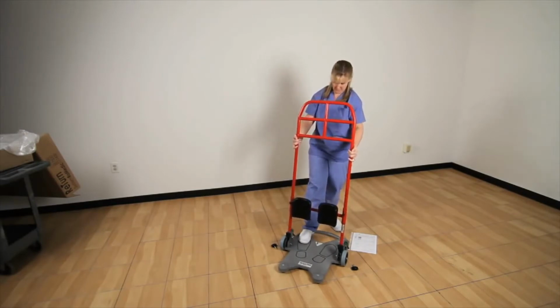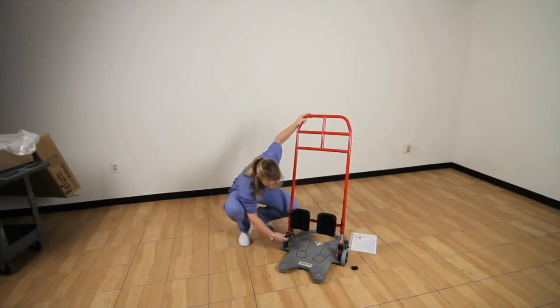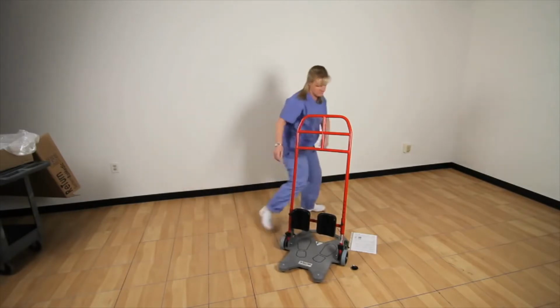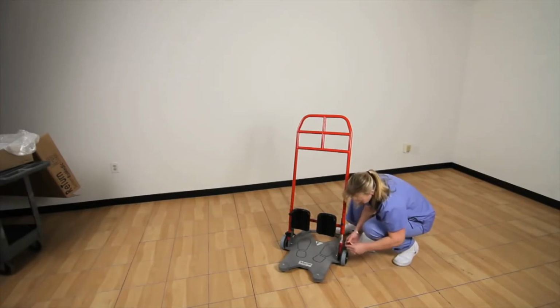Put the red ladder on the base so that the height adjustable knobs are facing the curved side of the base. Now, use the wing screws to fasten and tighten the ladder to the base. Turn the shin supports towards the heel marks on the base. Now the Return is ready for use.